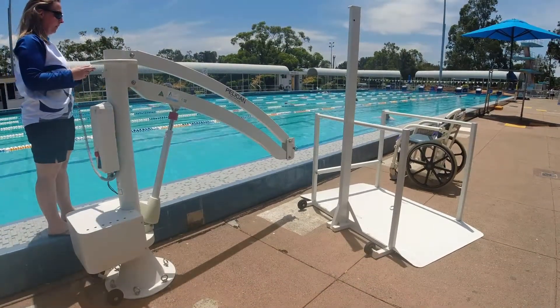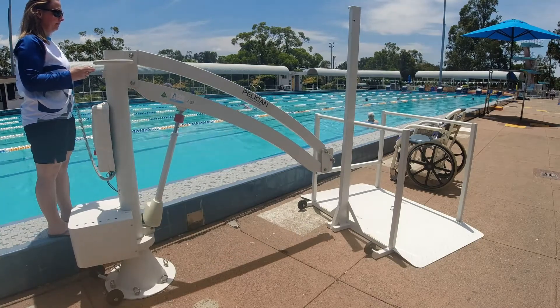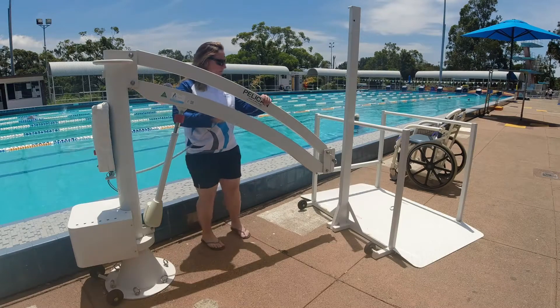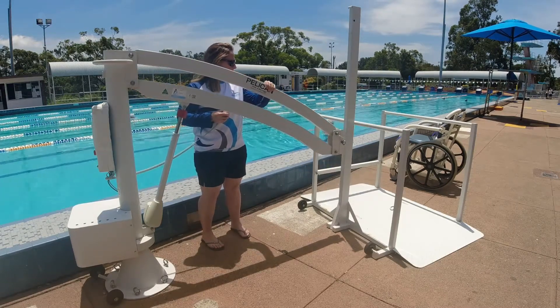Let's now look at the accessories. First up is the platform. There is no need to lift the platform — for transport to and from storage, push and pull using the trolley wheels and use the platform upright as the handle.